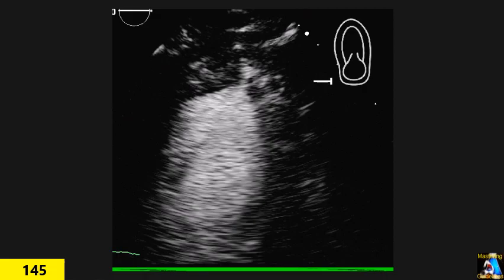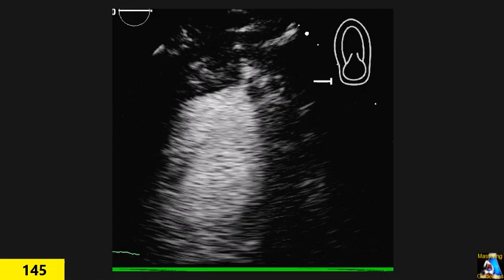Here is another view at the apical level at a slightly different axis. As you can see, I am trying to show some important features. Okay.